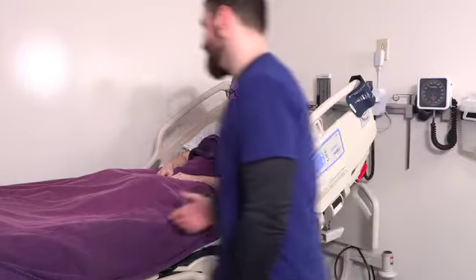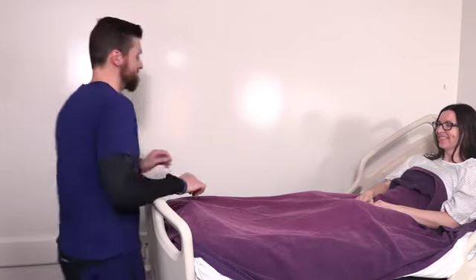So what you need to do is raise that bed up to the real working height. I'm a tall guy. I've always told my patients every time I'm raising them up in the bed, hey, you're going for a little ride, because that's important for them to know that they're going to be really high up in the air, but it's for my safety as well.